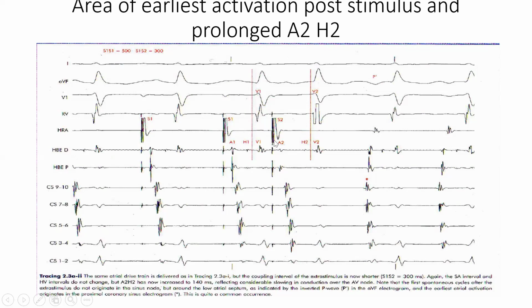When they made the pacing faster, what did you notice? Yeah, someone is already telling us. AV nodal delays. So Dr. Bassi, did you notice something here? But do you see where my circle is? Yes, where you have A2 S2. Is this telling you something? What is it telling you?